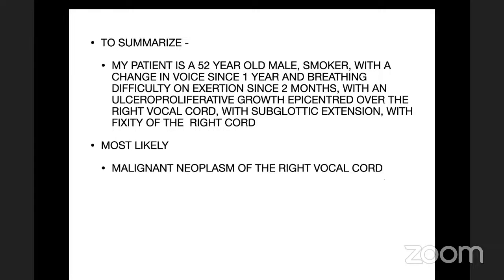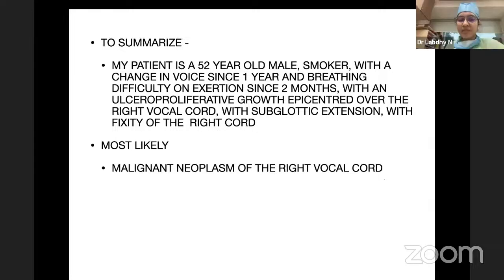Not very sure that the answer is correct. I'm not able to hear you clearly, Labdi. Could you please come again? From the superior surface of the true vocal cord till 1 centimeter below it is the glottic larynx.